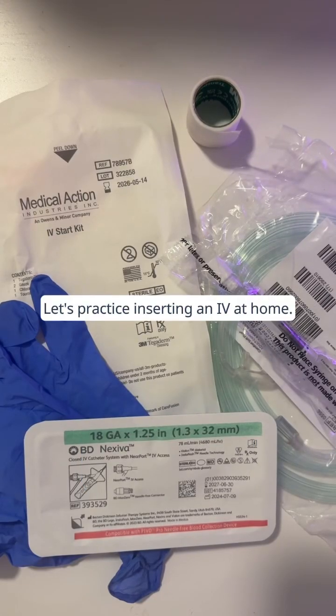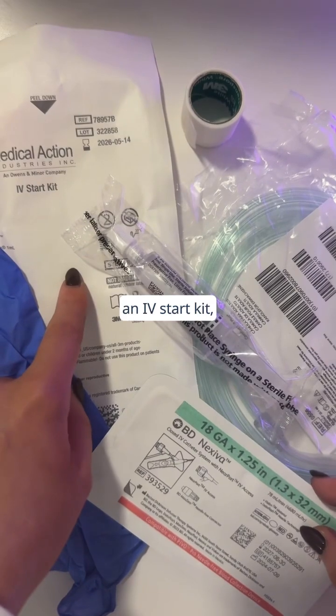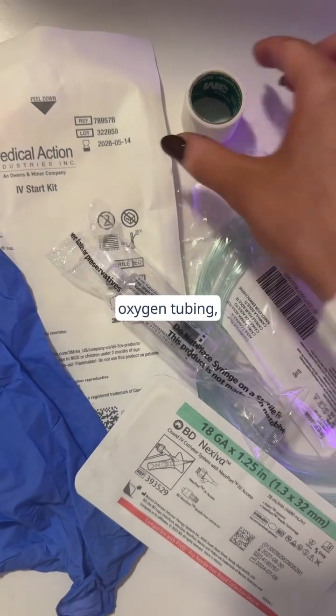Let's practice inserting an IV at home. Here's what you'll need: an IV catheter, gloves, an IV start kit, a flush, oxygen tubing, and some tape.